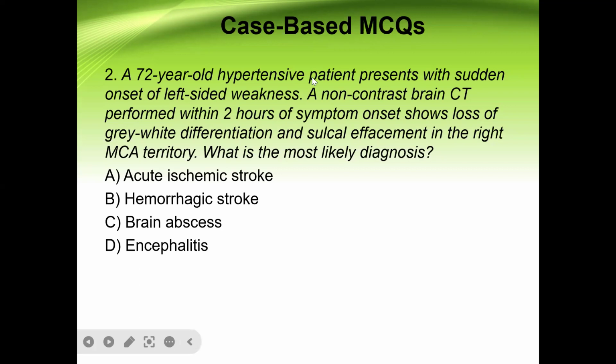No chorus answer. I want to see who is answering. Anybody? Dr. Friday Chisoga, are you answering that question? Okay. Bless, who is answering? I'm not sure about the answer. Okay. Anybody that is sure should answer for me, please. It's hemorrhagic stroke, sir. I don't agree with you. Anybody else?